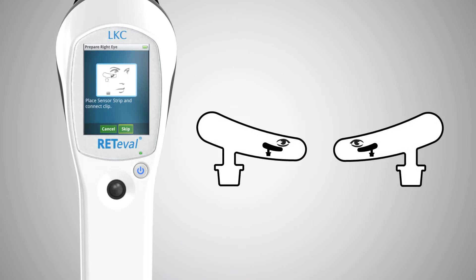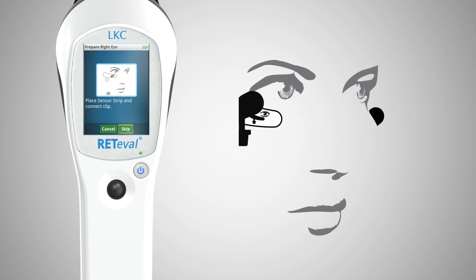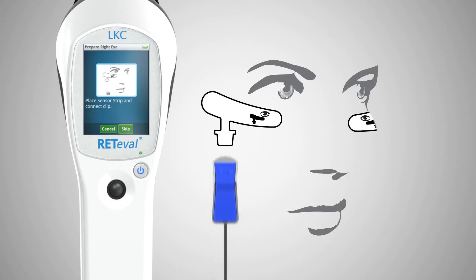The self-adhering sensor strips are designed for proper location and orientation. Place one below each eye. Using the simple clip connector, attach the Redaval device to one of the sensor strips as shown by the graphic on the device display.